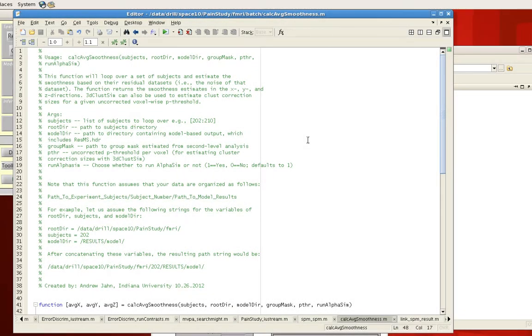Calc Average Smoothness is a brief program that I wrote the other day, which will estimate the smoothness across the x, y, and z directions across all of your subjects within your experiment.